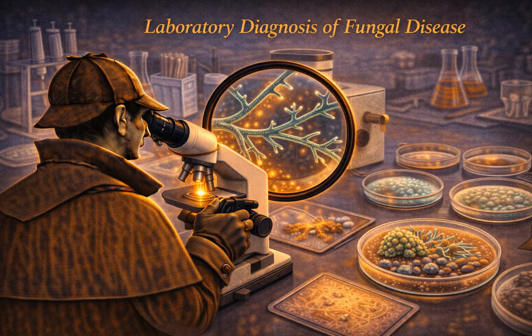Fungi are generally considered gram-positive. They hold the crystal violet dye. So they look purple. They look purple. Candida species, for instance, appear as large purple budding ovals. I want to really emphasize large here. A yeast cell is huge compared to a typical bacterium. A Staphylococcus bacteria is a tiny dot. Candida is a giant oval. If you're looking at a blood culture smear and you see giant purple footballs, that's Candida.